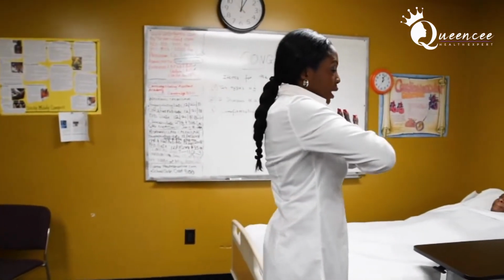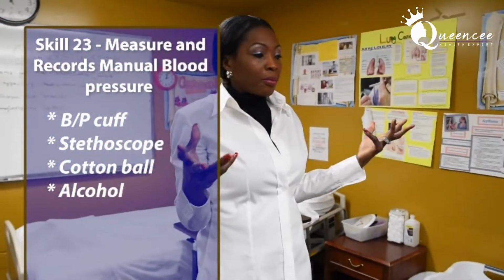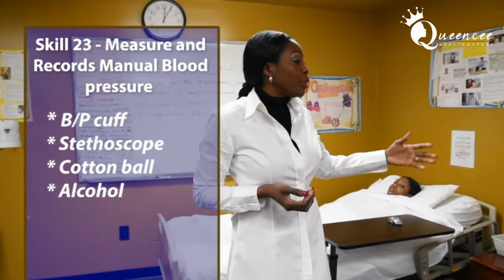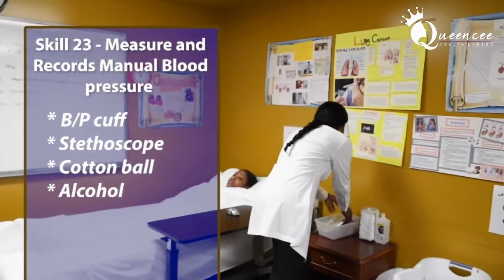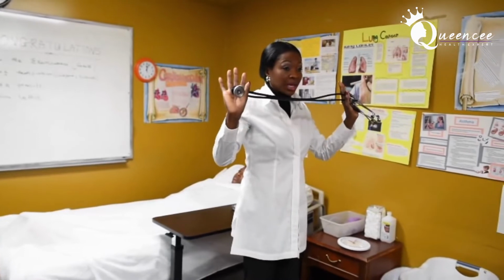Blood pressure is also part of our recording skill. Write this down, the equipment you need in order to perform this skill for the examiner. You're going to need a blood pressure cuff. You're going to need a stethoscope, which will be provided for you, so you don't have to bring your own, because you are using the examiner's stethoscope, the double lumen stethoscope, the day of the GNA exam.